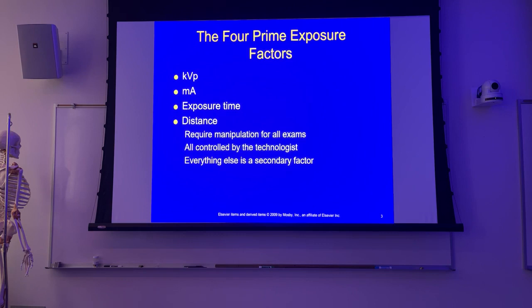We use one specific thing to control intensity, and that's mAs, but everything affects intensity. And then energy, it may or may not change it. Remember that the things that affect energy are 2 things: if it affects peak energy, that's kVp, and if it affects average energy, then we've got some other things in there as well. But the thing I don't want you to be confused on is voltage ripple, okay?